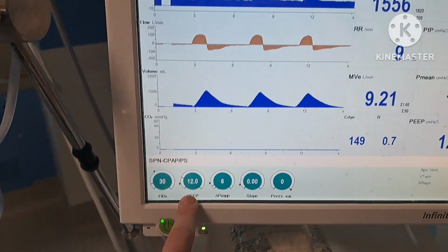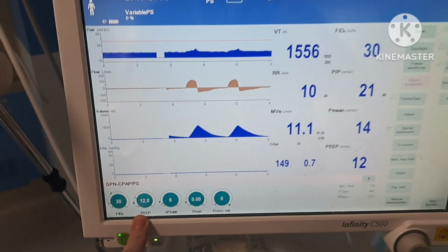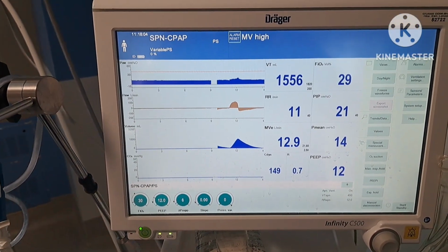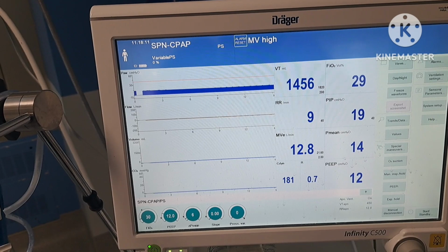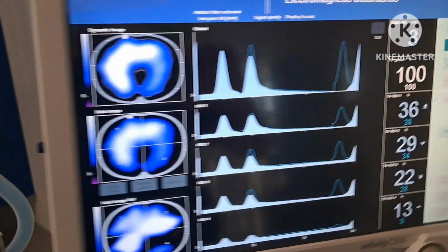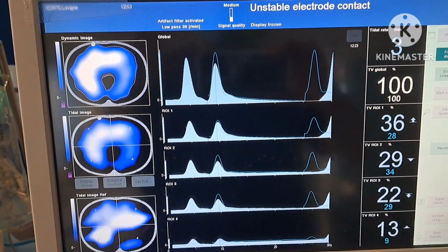Now I'm going to start going back down from 16, we went to 14 to 12. So the PEEP study will be done incrementally and decrementally to adjust. If we stay on conventional mode, we'll have the optimal PEEP. Yep, all right. So we're down to a PEEP of 10, and I came back because they called me, so I was in the middle of doing the PEEP study.